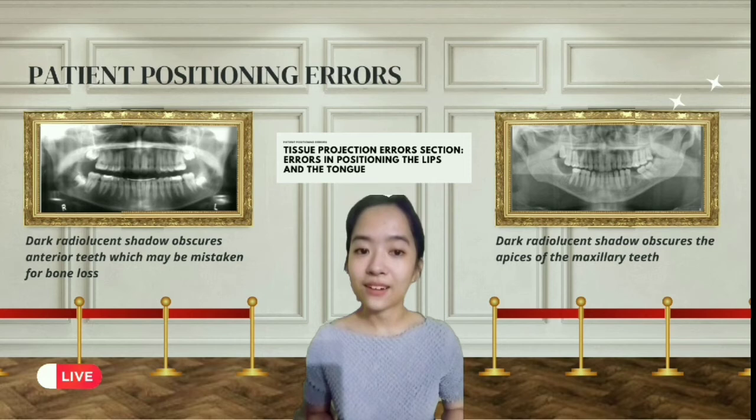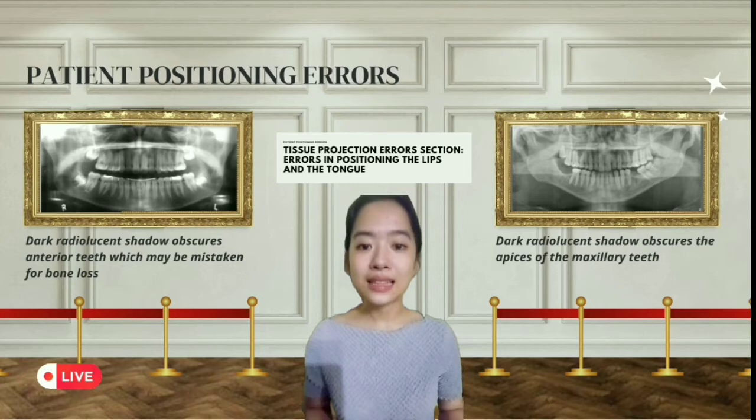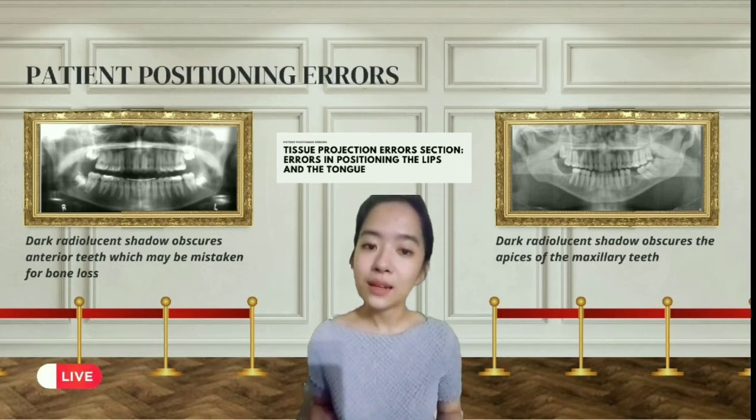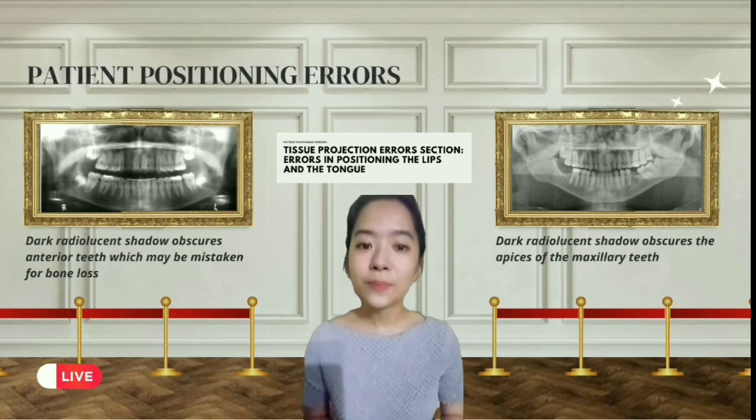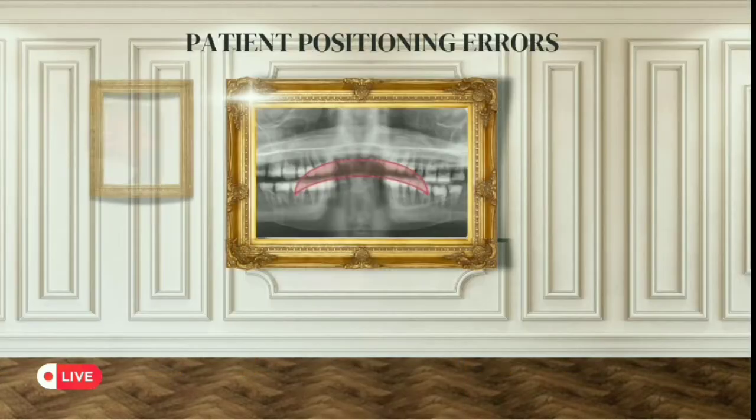Through these errors, you can see how important it is to maintain and instruct proper patient positioning, and these errors particularly can be prevented by closing the lips and holding the tongue against the hard palate during exposure.